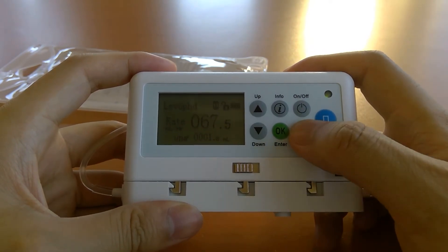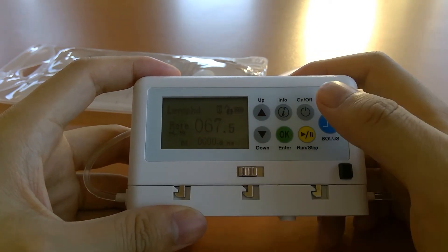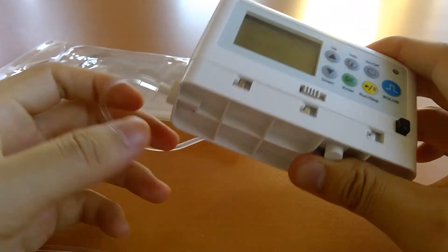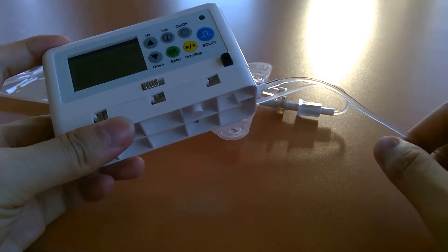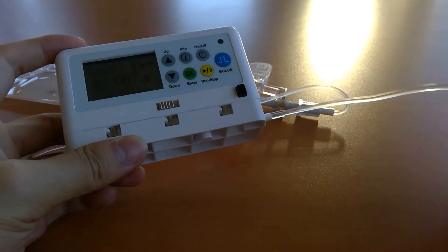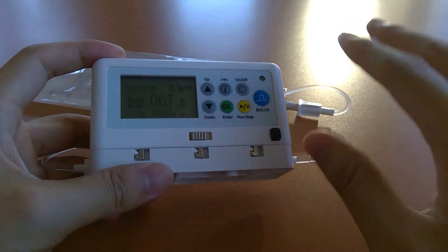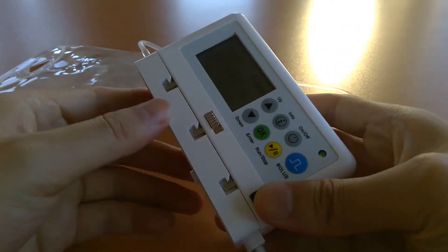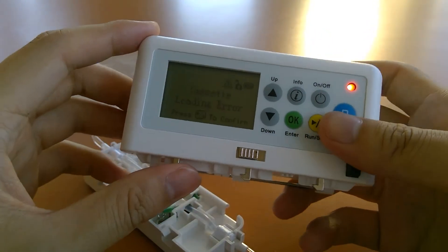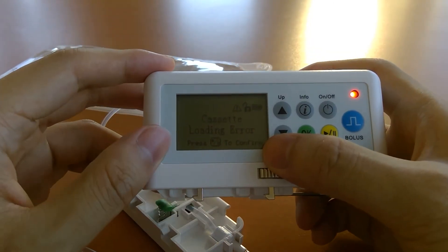The pump has upstream and downstream occlusion alarms constantly monitoring pressure. If there's a kink in the line, the pump detects it as a downstream occlusion, and if the kink resolves itself the pump simply resumes. To show what an error looks like, removing the cassette triggers a cassette loading error — you'll see a flashing red light, hear beeps, and see an exact description of the error on the screen.